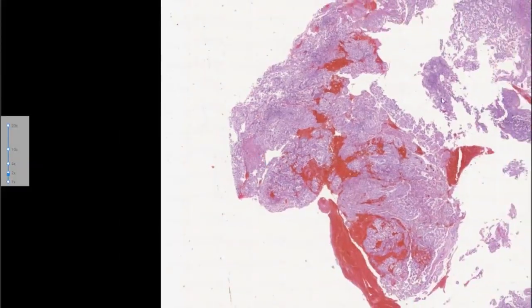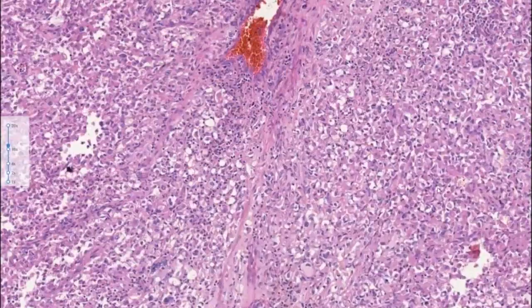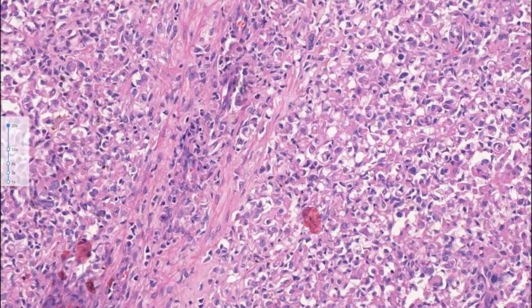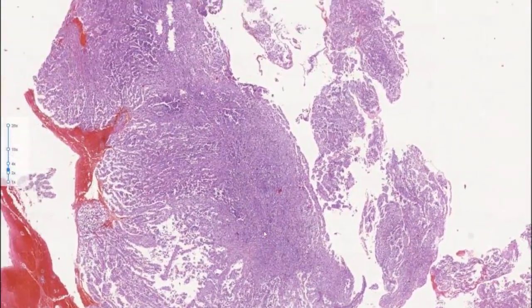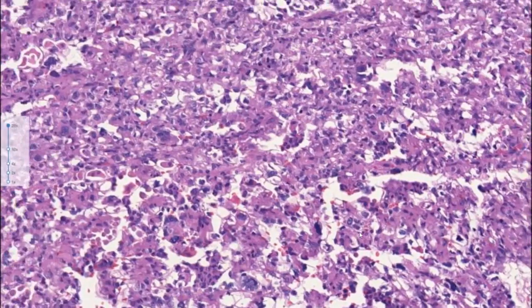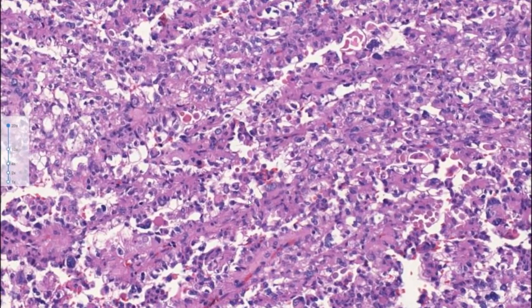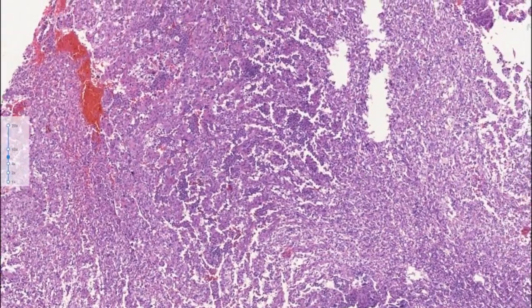Here you have that. So some variation. There is some mitotic activity, I know for sure in many areas. This one had actually several blocks, and there were for sure areas of brisk mitotic activity. So this is more compatible with a malignant neoplasm.